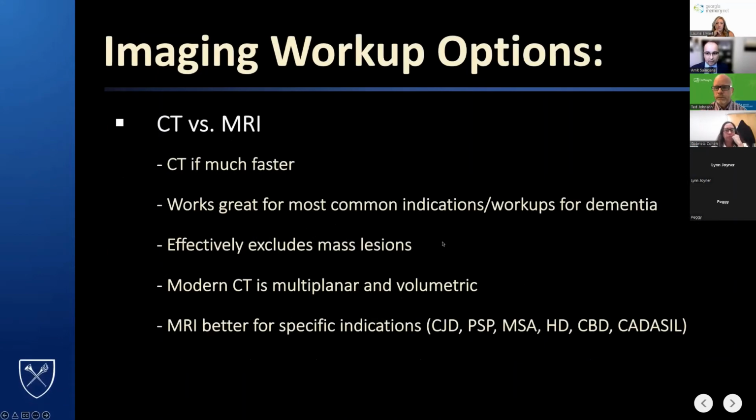All right, so great job on those cases. I wanted to talk a bit about the workups and modalities and contrast. And so relative strengths of CT and MRI. So CT is fast, it's less expensive.